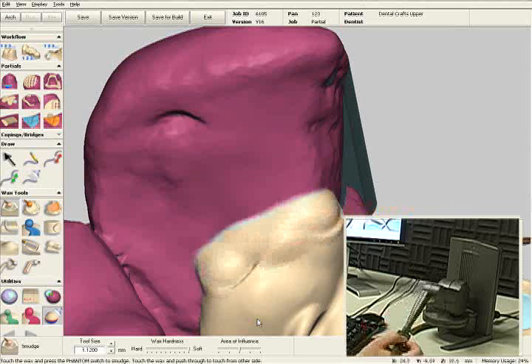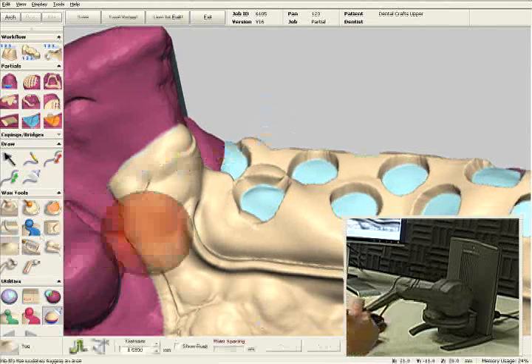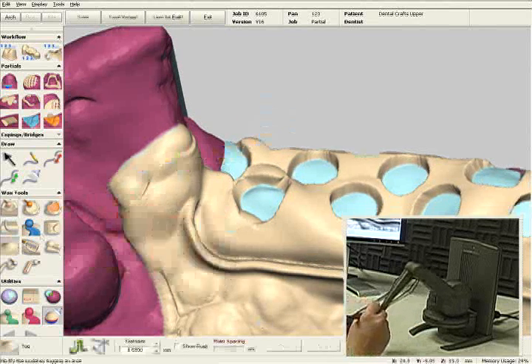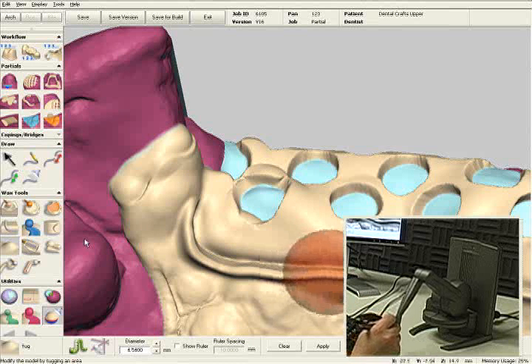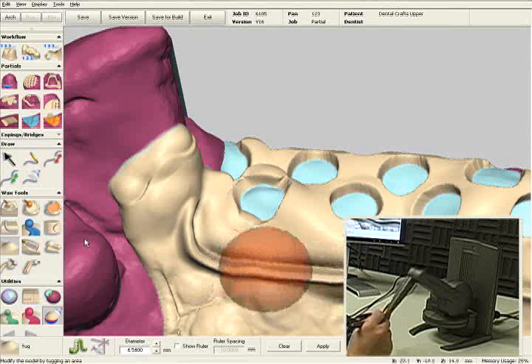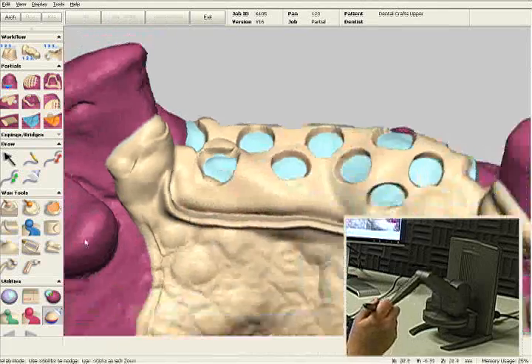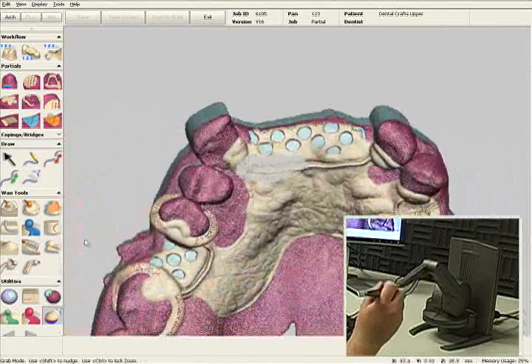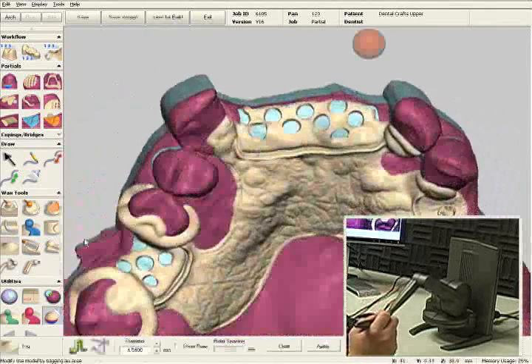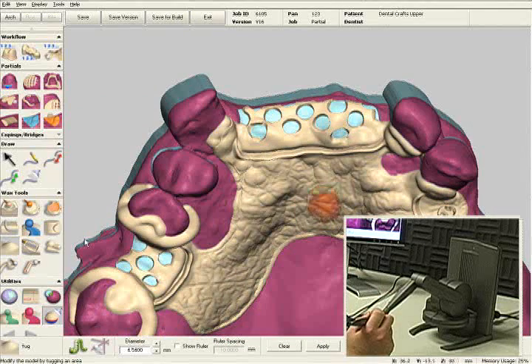The haptic device also allows me to manipulate anything that I see on the screen. Working this way is very similar to using your traditional wax tools, making it very easy to learn and use. In the following videos, I'm going to demonstrate how to survey, design and wax this partial.